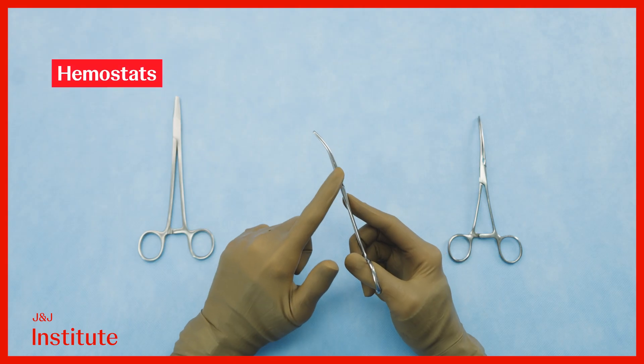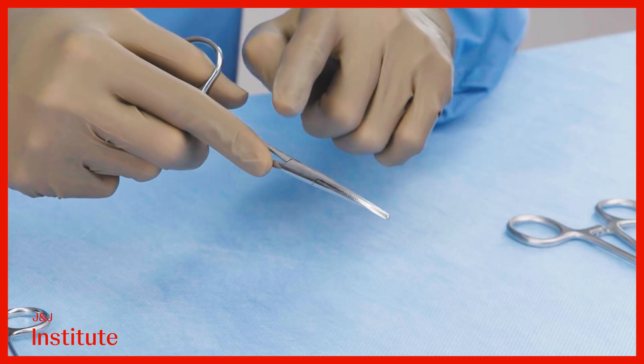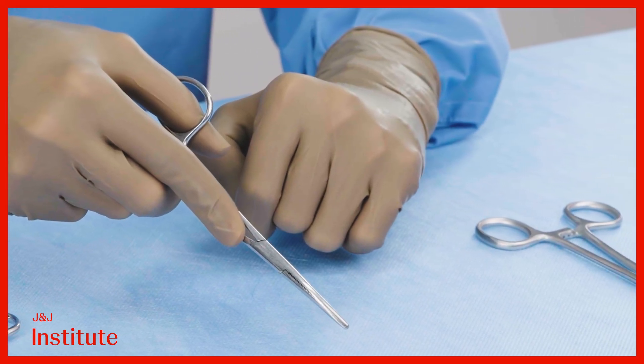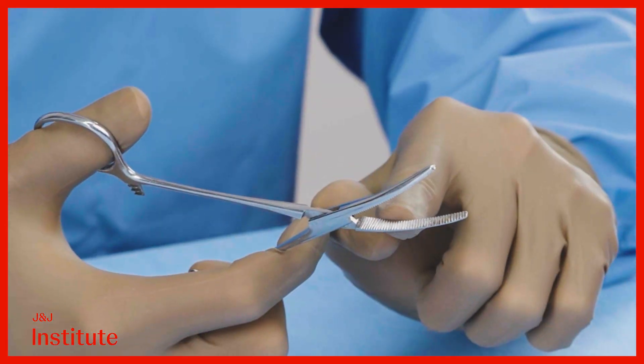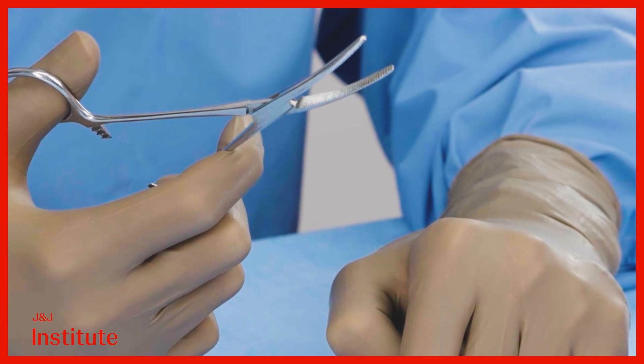Hemostats may be curved or straight. When gripping a curved hemostat, the curve usually points down at the surgical field. The jaws of the hemostat are milled transversely regardless of its shape or size.